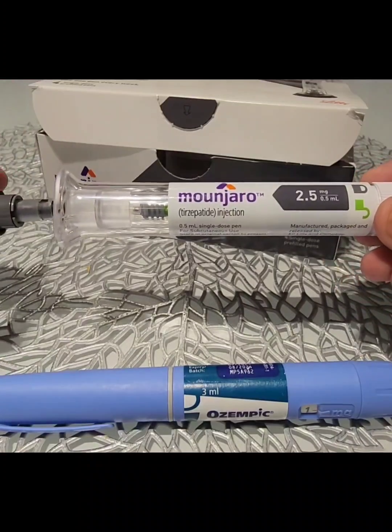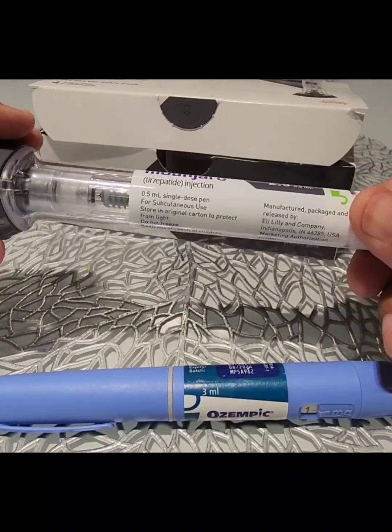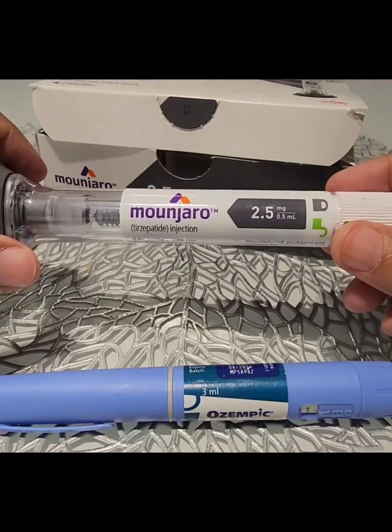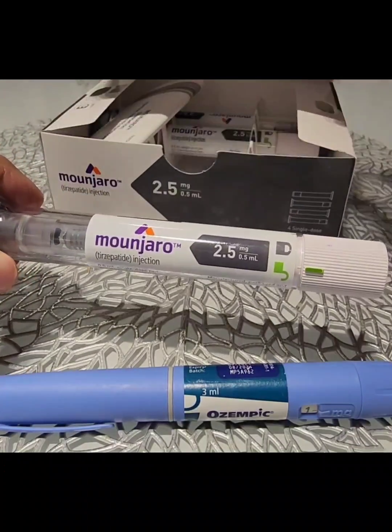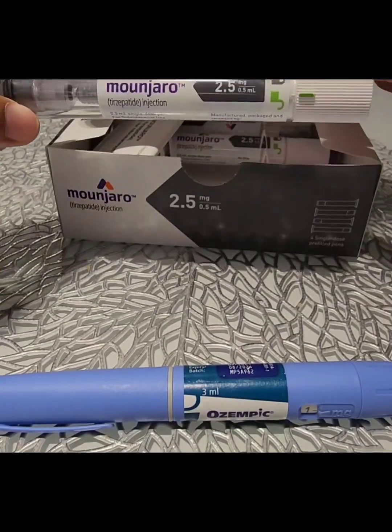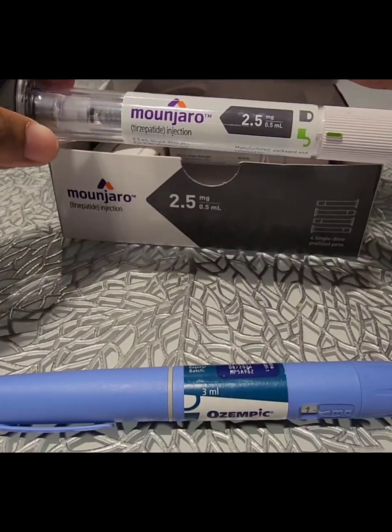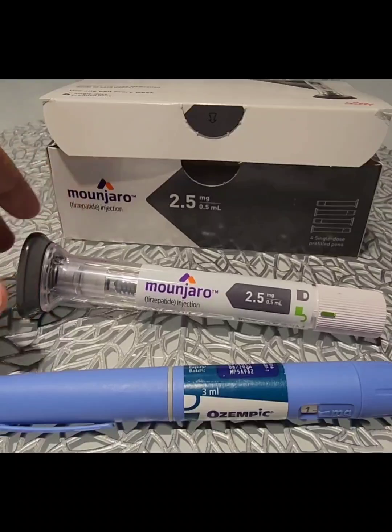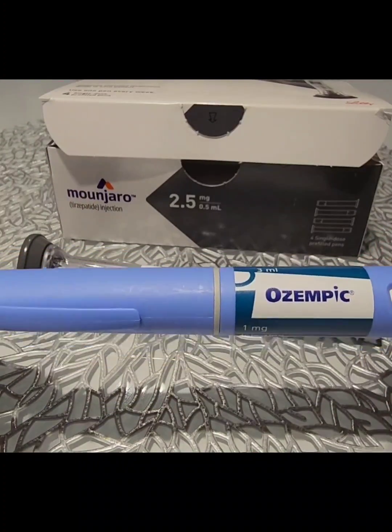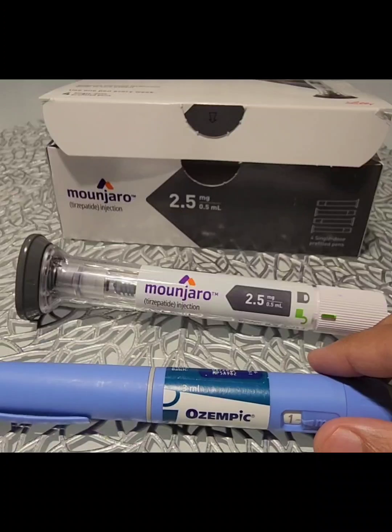Each pen will have to be discarded at the end of usage because this is a single-use disposable pen. Next week, you will have to use the next pen. So the box with four pens is actually for the whole month, whereas for Ozempic, the box with one pen and four needles is meant to be used for the whole month.